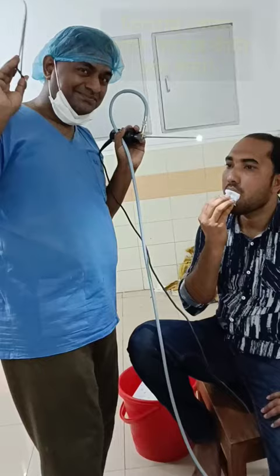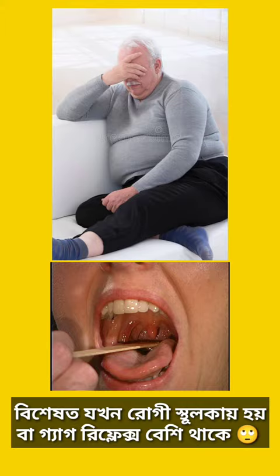Removing a foreign body, especially a fish bone from the base of the tongue, is sometimes a little tricky — especially when the patient is very obese or has a huge gag reflex.